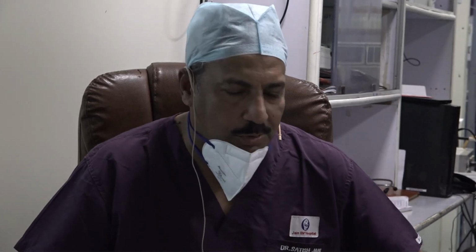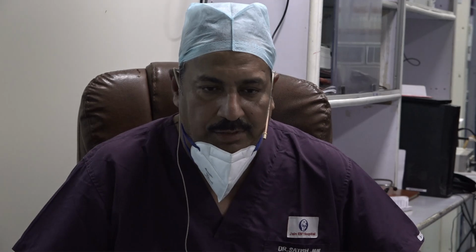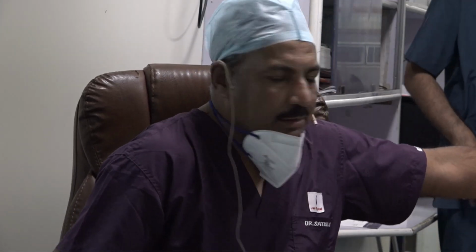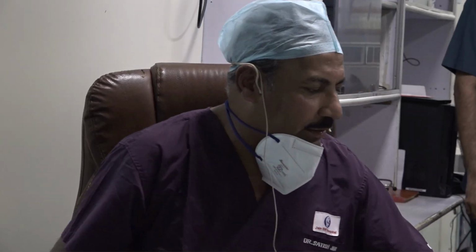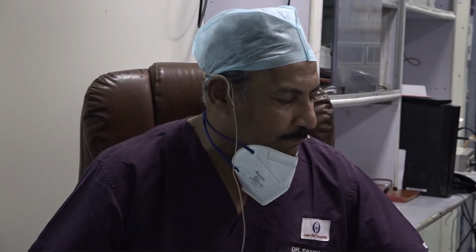So today we are doing 2 cases, looking at the time scenario, tympanoplasty and cochlear implant. Tomorrow we have more advanced cases, more variety of cases. So tomorrow again we'll be having cochlear implant for some malformation, IP malformation, incomplete partition. Then we'll be having some stapes cases, interesting ones. Then we'll be having paraganglioma. Then we'll be having surgery for malignant otitis externa, a sort of subtotal petrosectomy.